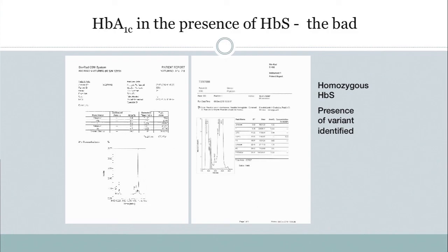Here is the bad: hemoglobin S. On the left is a patient with homozygous hemoglobin S; on the right, a similar patient analyzed on the D-100. The presence of the variant is identified, we know what it is, we know that any result generated is invalid, and so we can report that this patient has homozygous S and that caution is needed in treating this patient for diabetes.